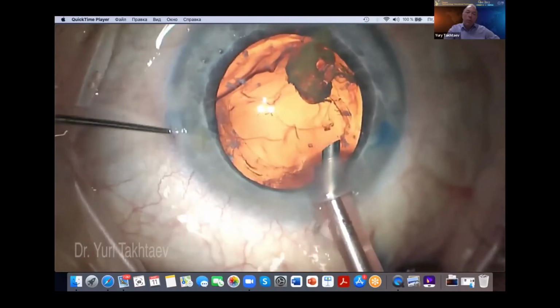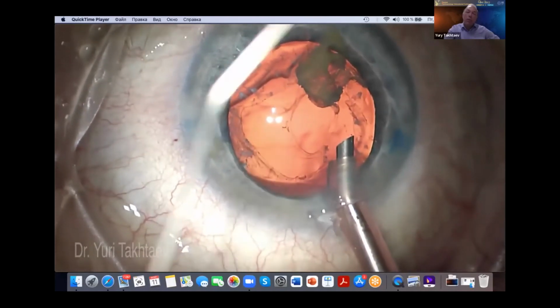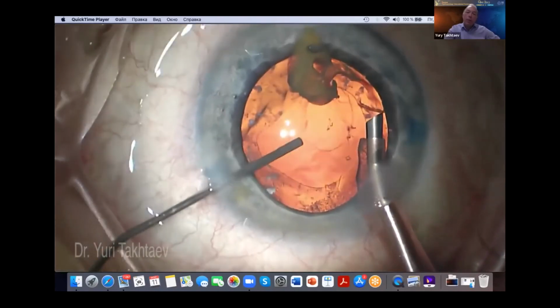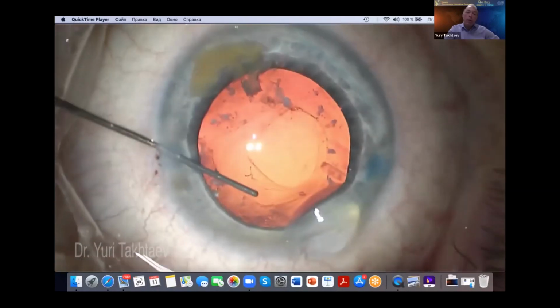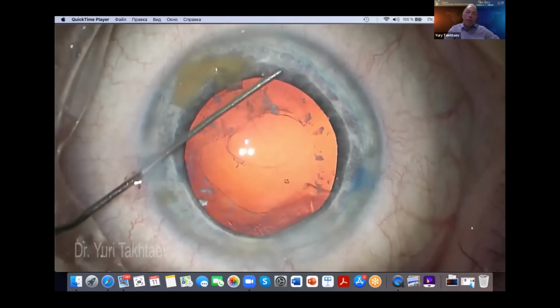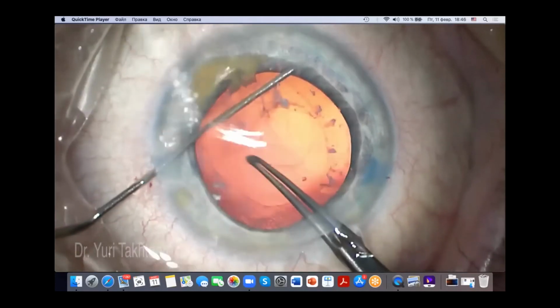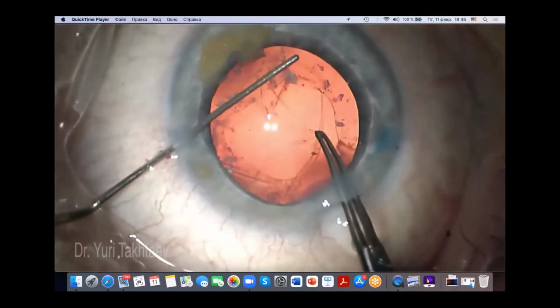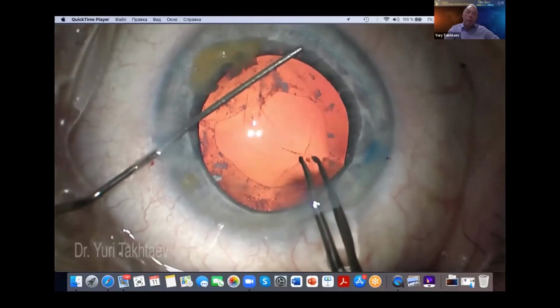And still, we want to put the multifocal implant in the back, so I don't want to put the lens in the sulcus. That is why we put the viscoelastic, just to stabilize the capsule. And I decide to put the vitreous back. At the same time, I extend and try to round the linear capsule defect to create the posterior rhexis without vitrectomy.